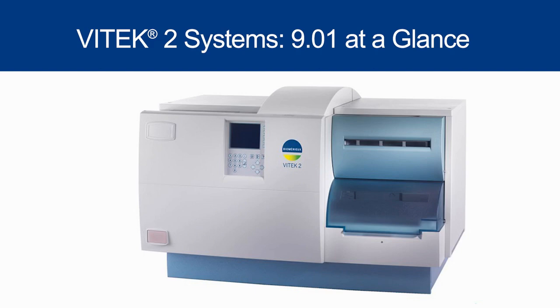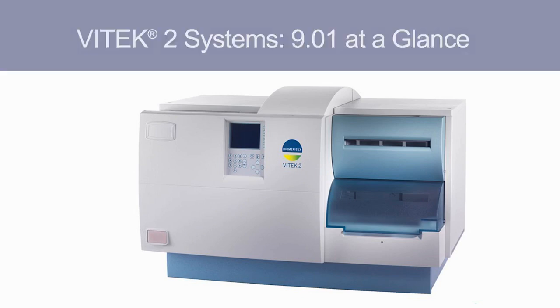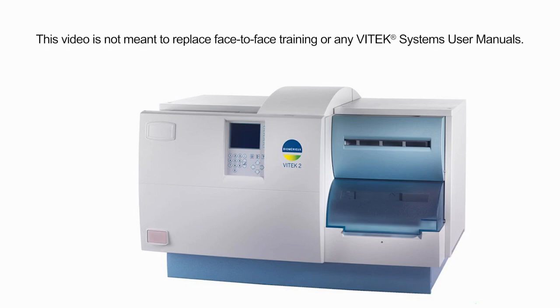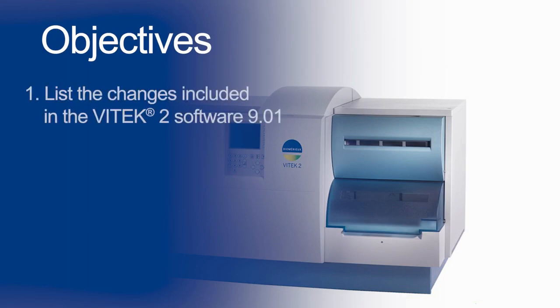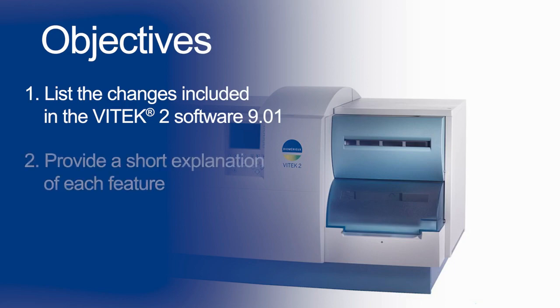This video will provide a brief glimpse at the major changes coming your way with the new Vitek 2 system software version 9.01. This video is not meant to replace face-to-face training or any Vitek systems user manuals. By the end of this video, you will be able to list the changes included in the Vitek 2 software 9.01 and provide a short explanation of each feature.